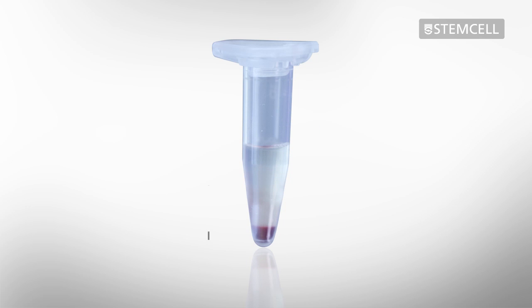After the incubation, the sample will be separated into two layers. The red blood cell pellet will be clearly visible at the bottom of the tube. The size of the RBC pellet can vary depending on the hematocrit of the blood sample.